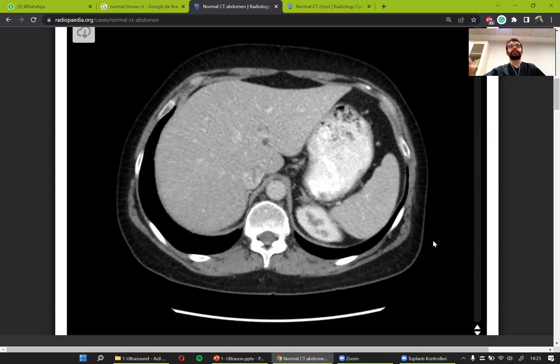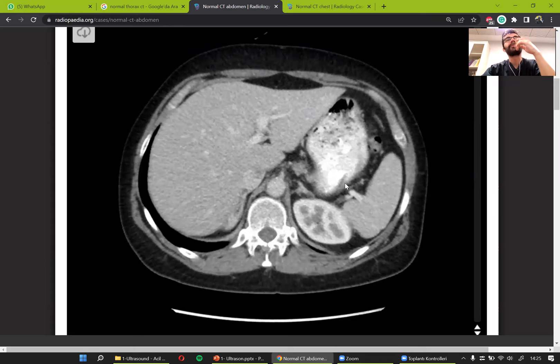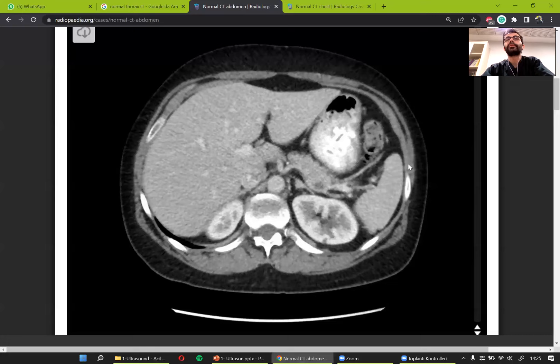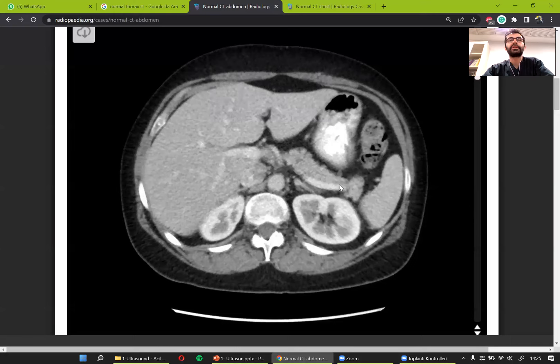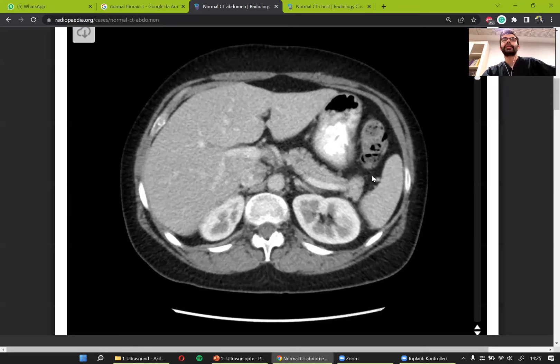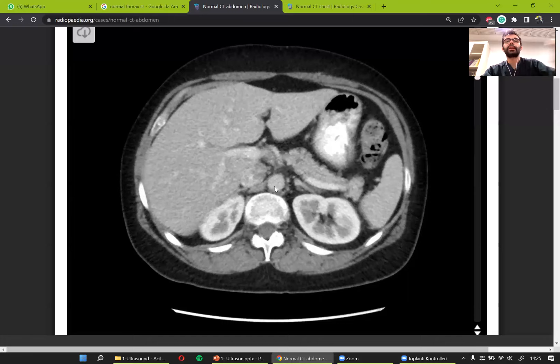Because we are looking at the abdomen, we are at a darker window level — the lungs are completely dark. We are looking at soft tissues only. On the right side I have the liver, on the left side the spleen. We see the pancreas here. Between the organs there is abdominal fat, which is dark and has low density. So we can see the borders of the organs pretty easily on a CT scan.